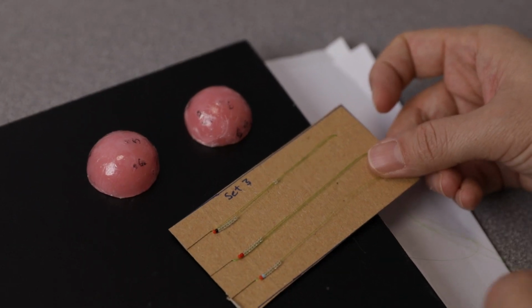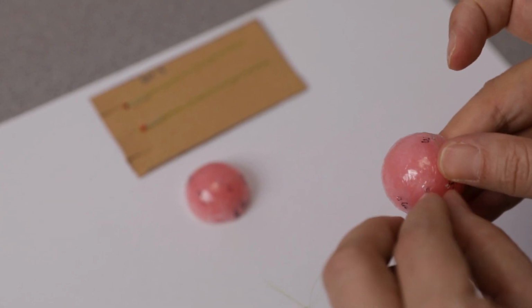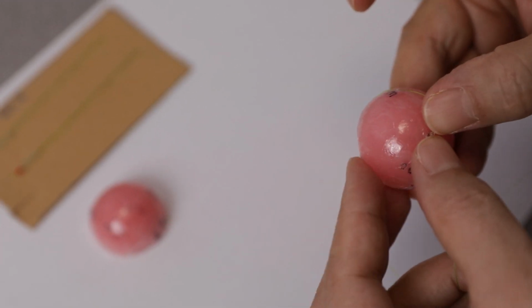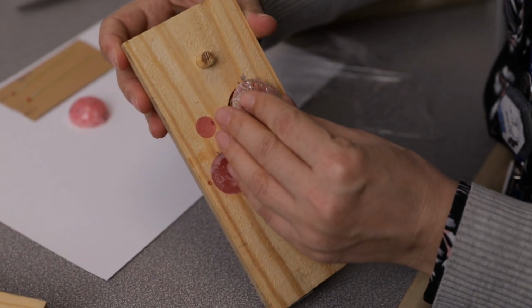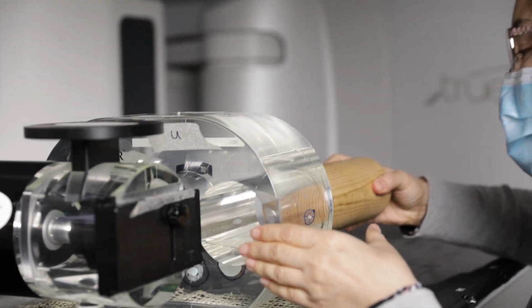Dose error of an order of 5% in such cases can result in 10 to 20% changes in tumor control probability, and up to 20 to 30% changes in normal tissue complication probabilities. We threaded the beads over a very thin plastic yarn and wrapped the beads around and inside the target volume, so we were able to obtain three-dimensional dosimetric information. We also used Gafchromic film to compare the measurements together, and also to the treatment planning system.